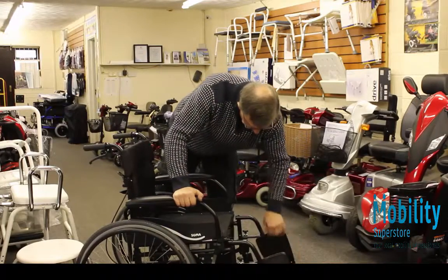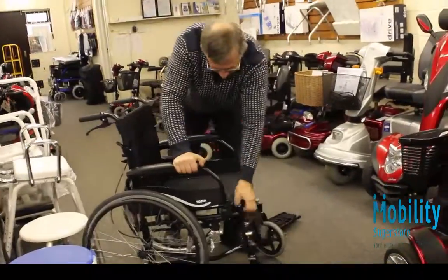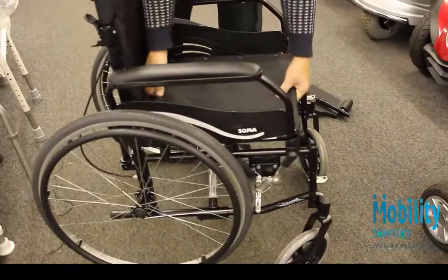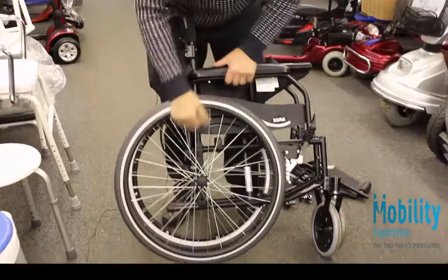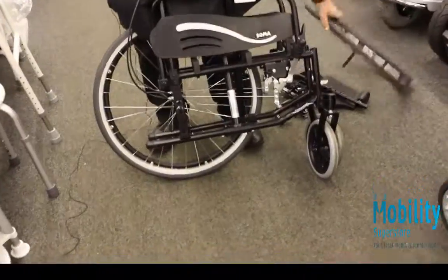First of all you have to take the footrests off and just put them to one side for now. Fold the chair together and if you just put the weight of the chair on one wheel on one side and press this button, the wheel will come off, and then turn it round.